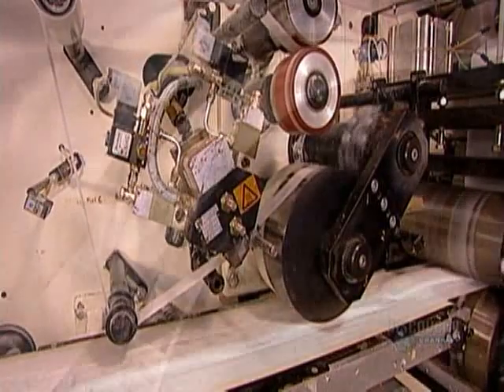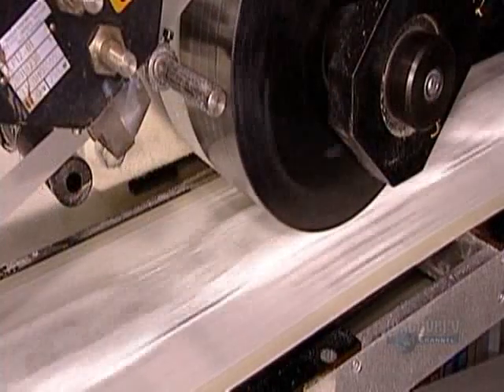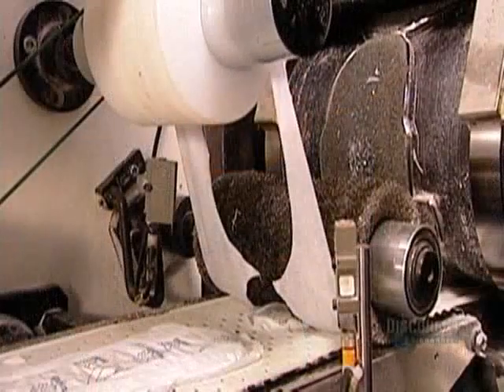Now the machine applies glue to a paper strip and to a pair of small paper rectangles. It slaps the strip on the back of the pad and the rectangles on the side flaps, called the wings. To secure the pad to underwear, you remove the paper to expose the adhesive.